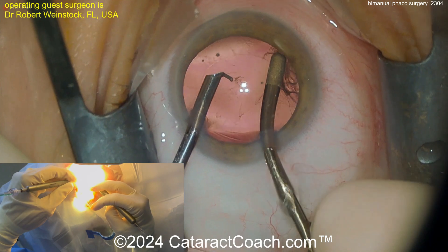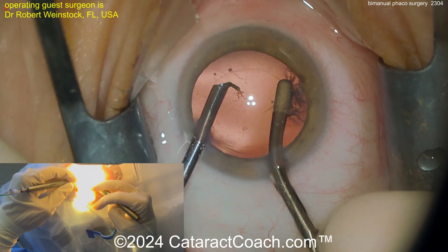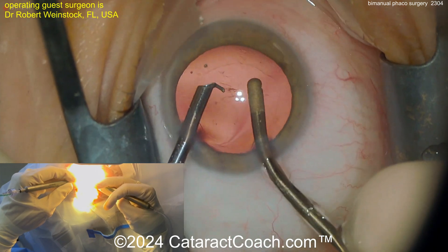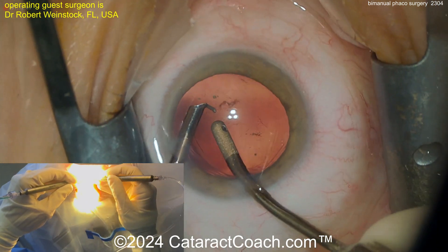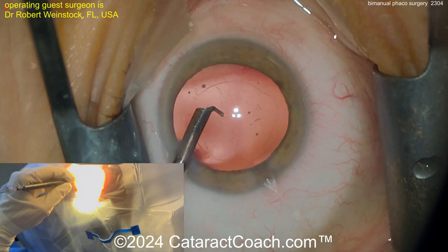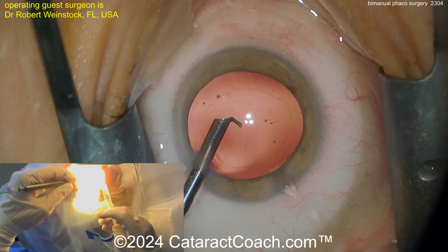Dr. Weinstock has done thousands — probably 10,000 or more cases with bimanual phaco. It's something he adopted and it works great in his hands. As you can see, it's a very efficient surgery. We're showing you the whole case here — you can see the hand view plus the microscope view.